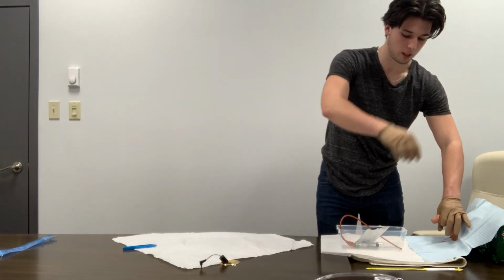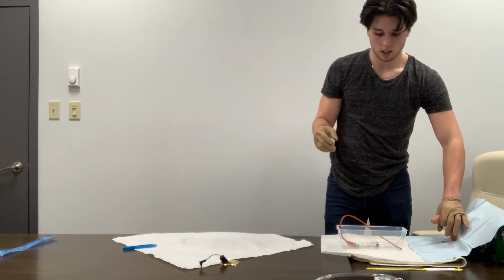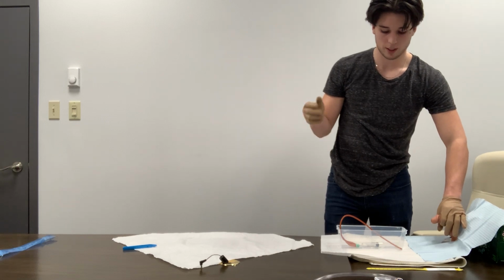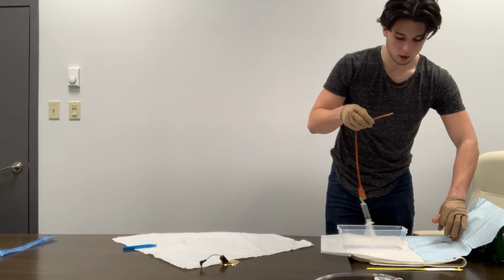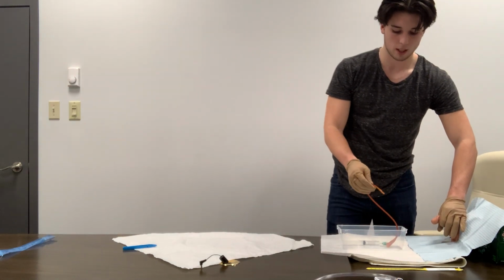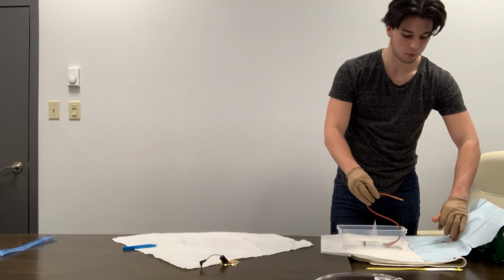And there we go. So now we can throw out our package as well. And so now that everything is thrown out, we are ready to insert the catheter. So we're going to grab the lubed up catheter here, and we're going to insert it into the patient. Now we're going to tell the patient to bear down and take some deep breaths as we insert it.